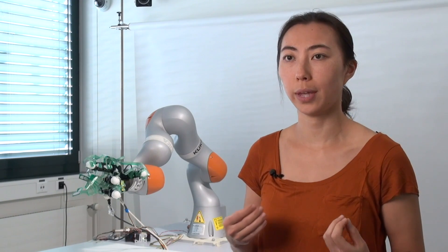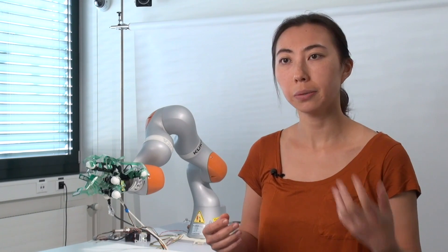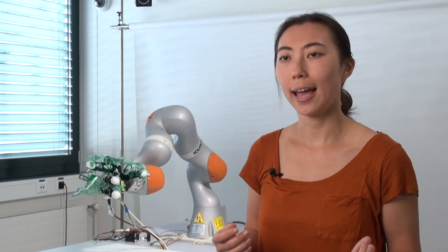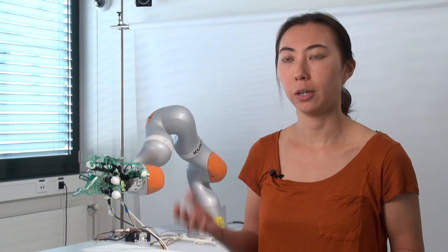This is exactly an implementation of shared control because what we have is user intention, basically the finger movements, and also the robotic automation which closes the hand around an object and keeps it there if the user wants, so that a grasp is more robust.